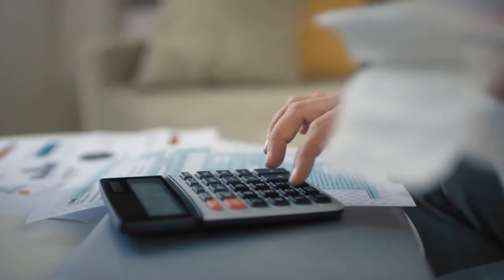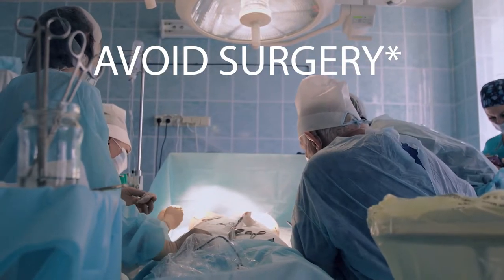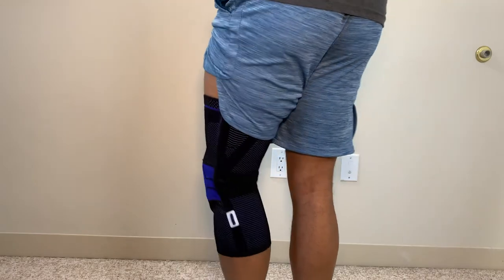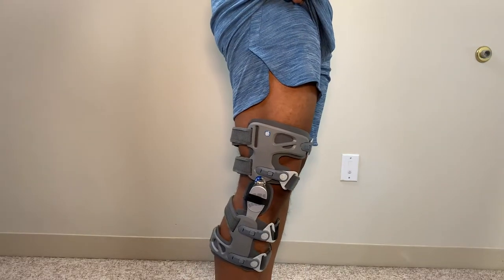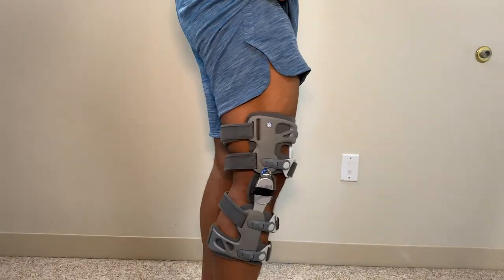When it comes to the value of these things, I highly recommend you don't focus on the cost of the item and really focus on what that brace is trying to do for you. The sleeve brace provides compressive treatment, similar to an ace bandage wrap. It can help with kneecap dislocation or excessive kneecap movement, and it's really good for runners with mild pain. But if you're dealing with osteoarthritis, chronic pain, or bone-on-bone, you're definitely going to want a rigid brace — something that will offload your knee, provide stability, and allow you to continue with your everyday activity.